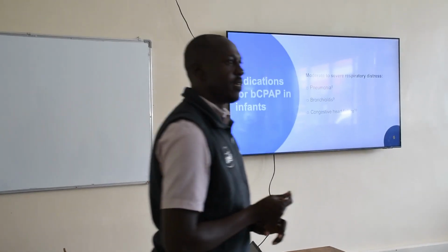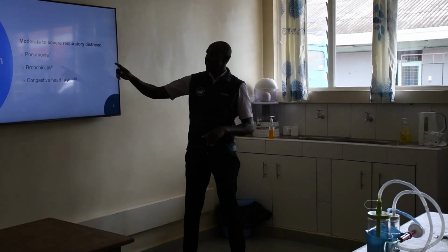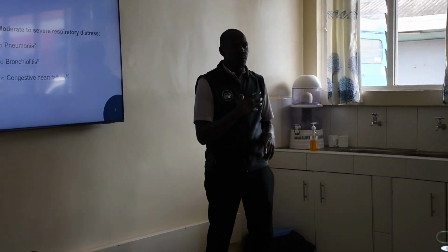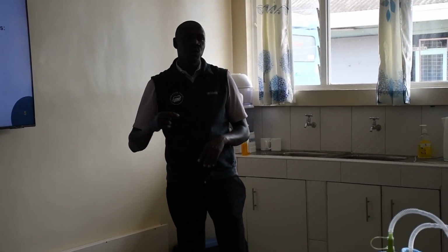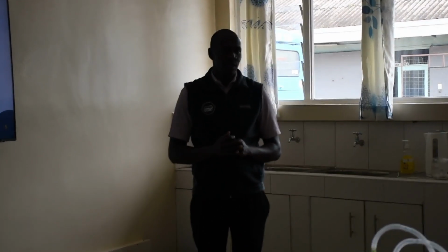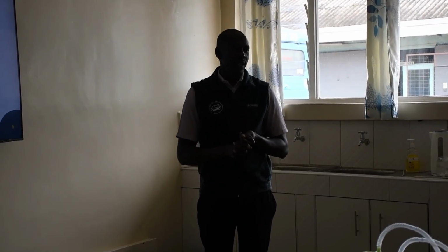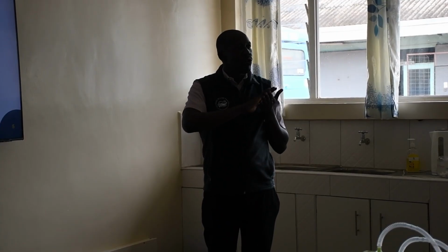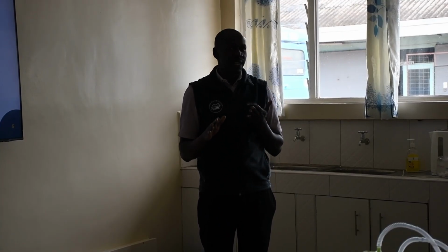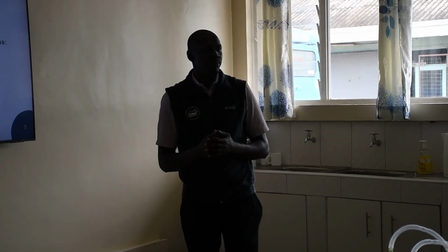Even in older babies, infants. Infants with severe pneumonia, infants with bronchiolitis, infants with congestive heart failure. These babies can benefit from CPAP therapy. Even some babies with an acute asthmatic attack, where you have used all the drugs to treat it and there's no improvement. In some settings, we can use CPAP to support them.